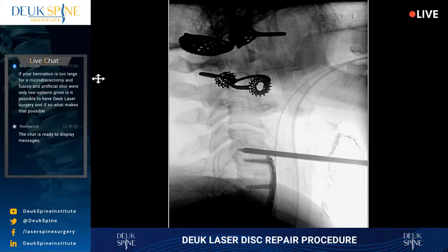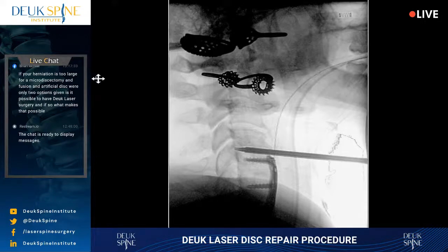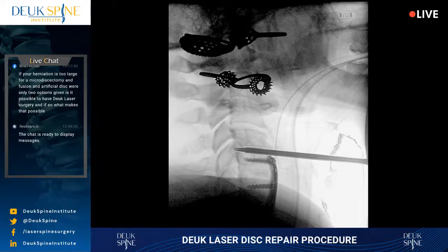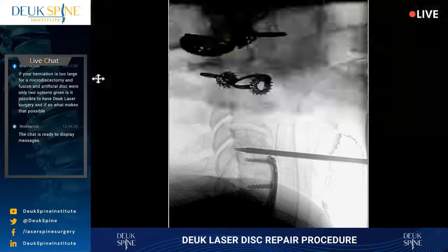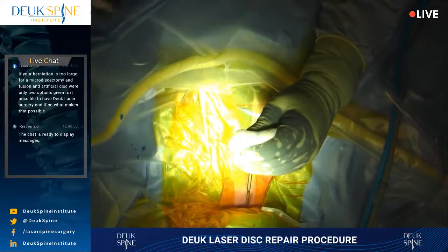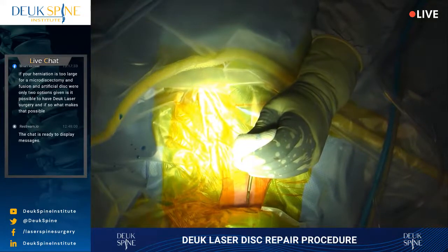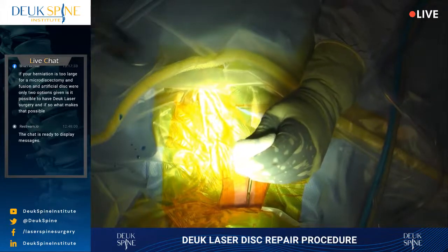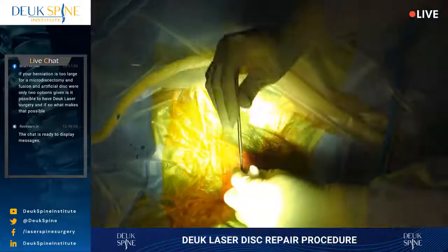I'm going to advance the dilator. Looks brutal, but it's actually a very calculated maneuver that I'm using. I'm trying to get my tube right to the back of the disc where that herniation is. And that should be good right about there. All right, we're done. Thank you, doctor.